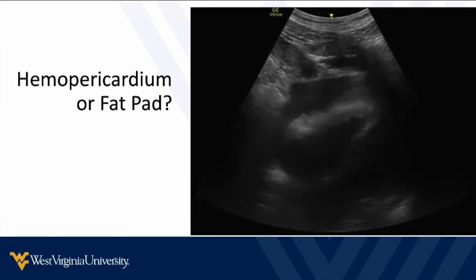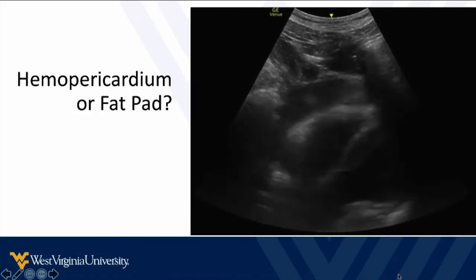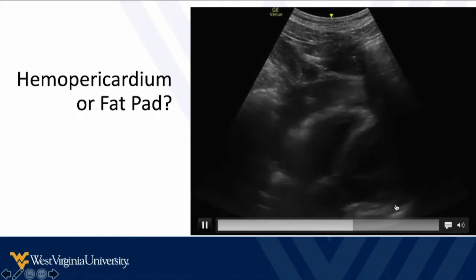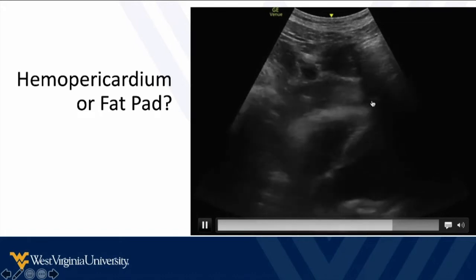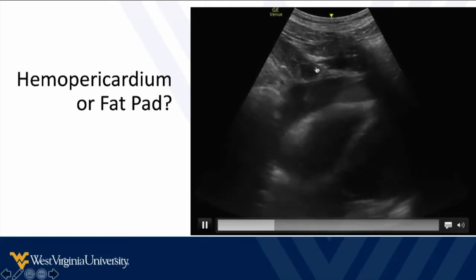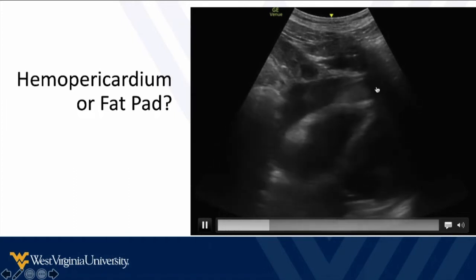This is a tough one, but I'm going to give you some things to look for. One, we see a little bit of fluid wrapping all the way around back here. See, there's a little bit of fluid, so it's circumferential. Now, this doesn't change shape very much, but some of it's black. The fat pad had that regularly distributed gray. This does not. We can even see some of this is fluid density. It's a little subtle, but there's a little bit of fluid density here.